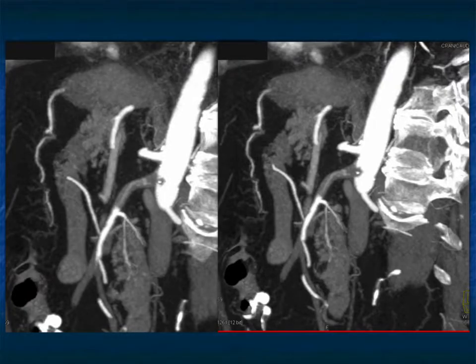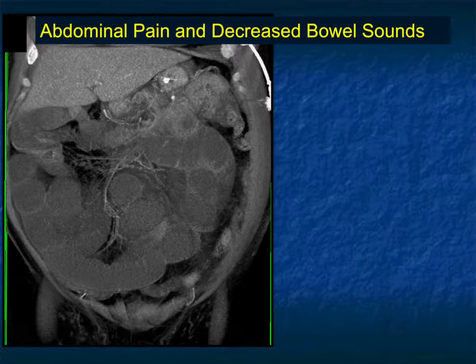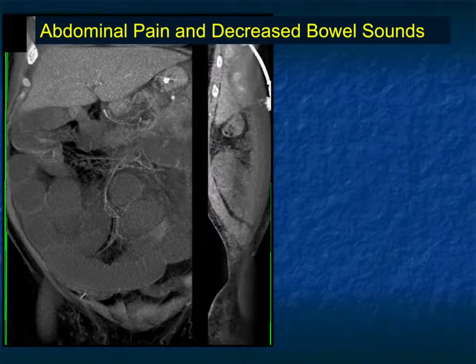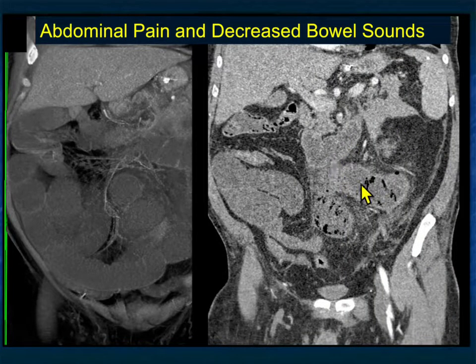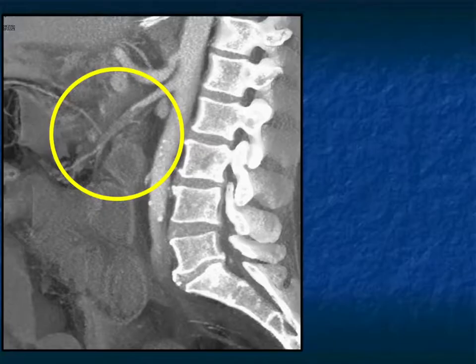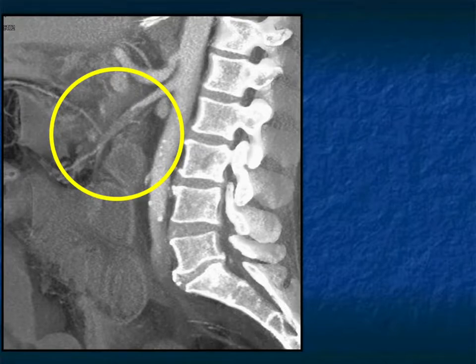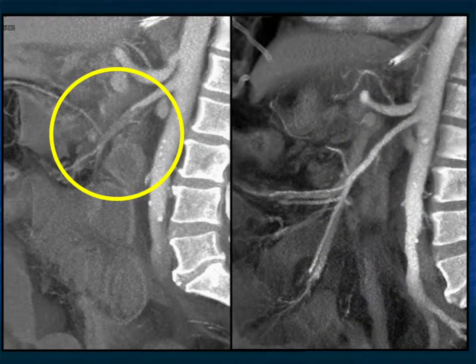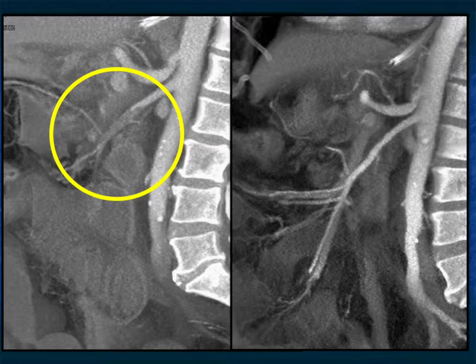Here's a nice example with significant proximal SMA occlusion nicely shown on MIP imaging, and also thrombus distally in the SMA. Another patient: the bowel is dilated but not enhancing well post-IV contrast — it looks like a non-contrast scan. On sagittal view, the SMA and celiac look great at their origins, but the SMA has extensive thrombus about five centimeters down. The patient went to surgery, the thrombus was removed, and here's the patient a week later. You need to see the thrombus and how extensive it is — it's not in the proximal vessel and easy to overlook.